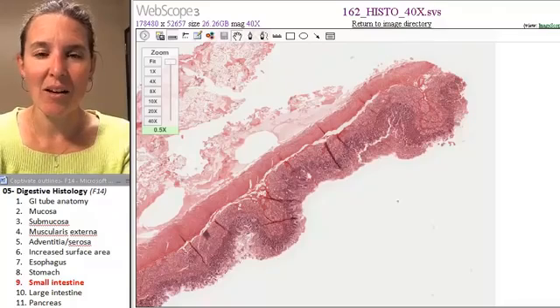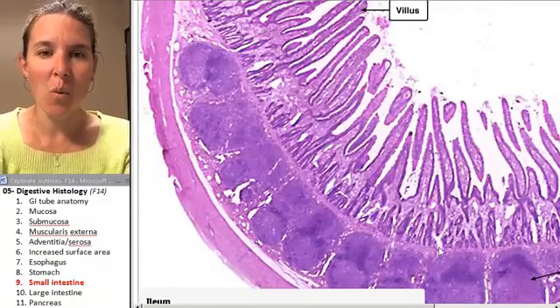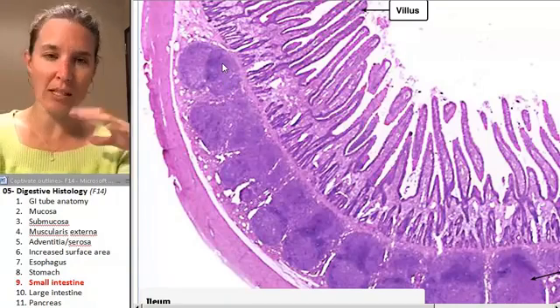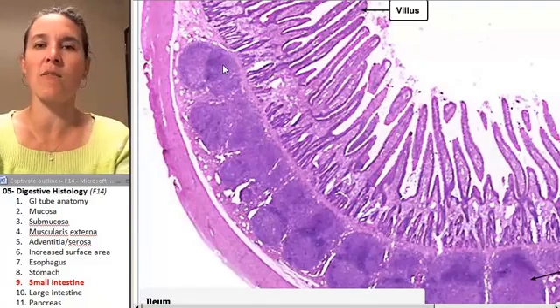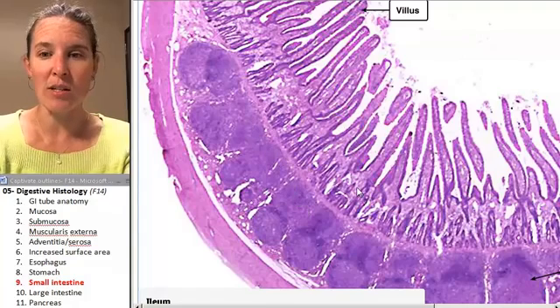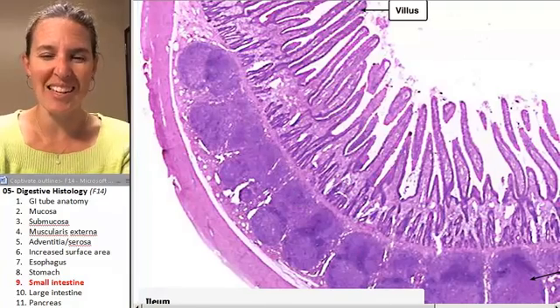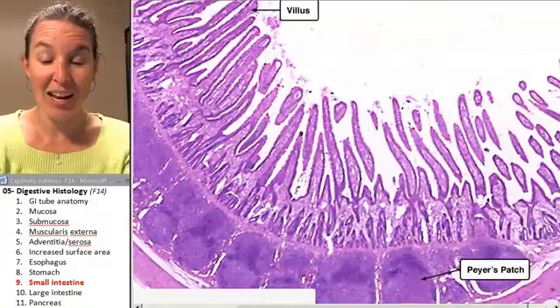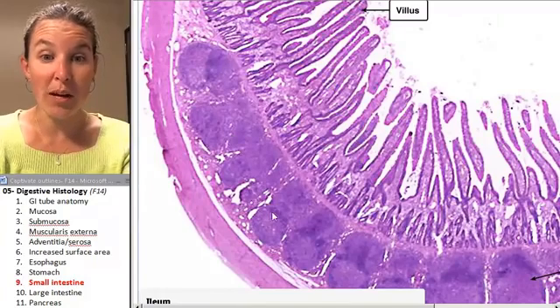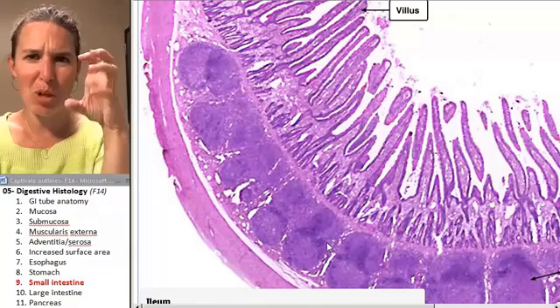Ready? You're not going to believe this. What? There's one. Now, I can't zoom in here. This is an ileum. I'm not fond of the ileum example that they have in the Michigan slide, so I went out into the world. Oh, and it looks like I can't see. I'm not cool with that. But check it out. Look at how many there are. 1, 2, 3, 4. Don't they look like big blobular structures?